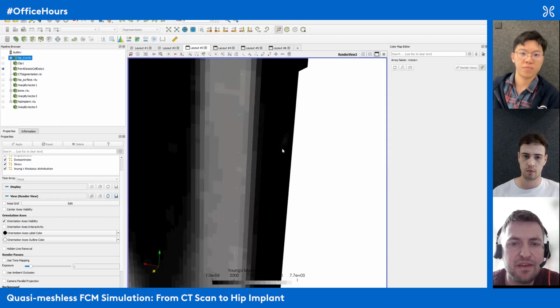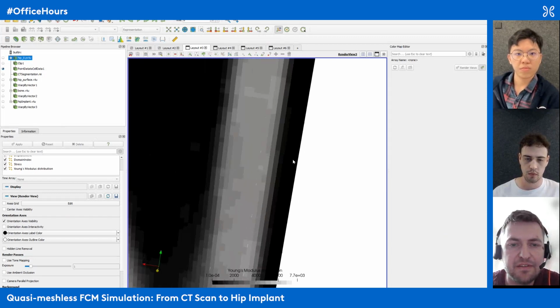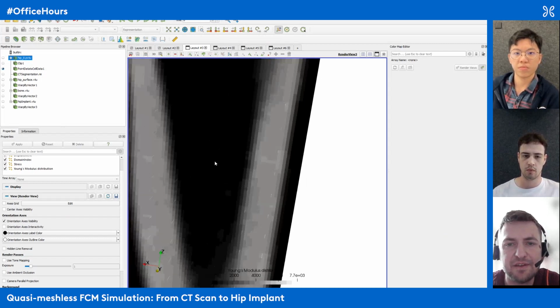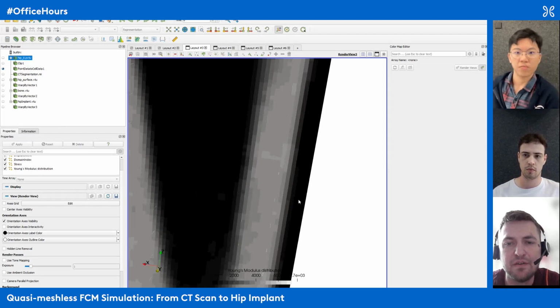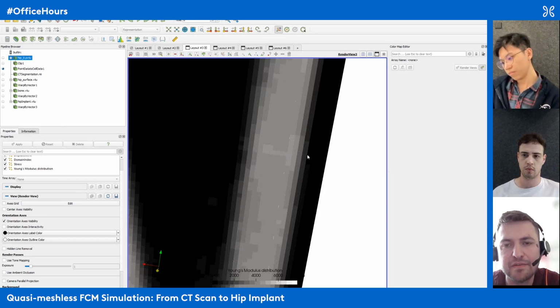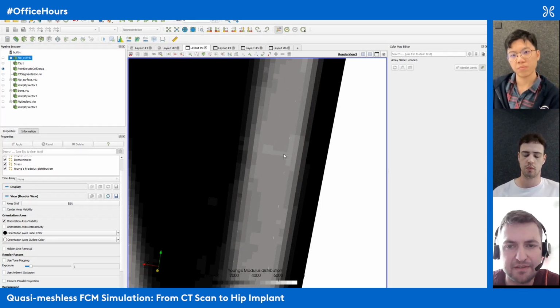And if we zoom in, you see that there are dark areas, and then there are brighter areas, and there are darker areas again, which are basically intensity values. So wherever we are dark, we know that there is no material. It's something which is very soft. Where if we go towards brighter and brighter areas, we see that there is material, there is bone, there is even more bone, it's even brighter. And then as we cross again towards the middle of the bone, we see that it becomes darker and darker. And this intensity also represents how stiff the material is, right?